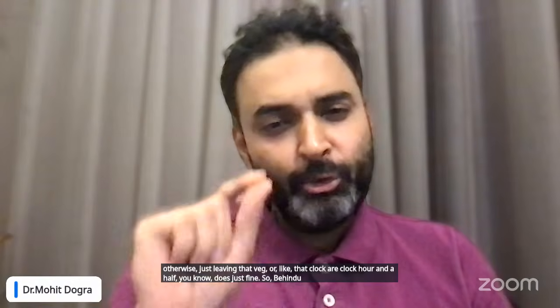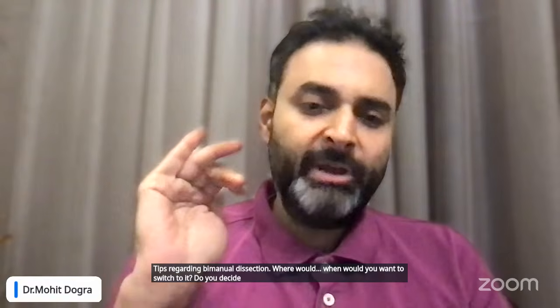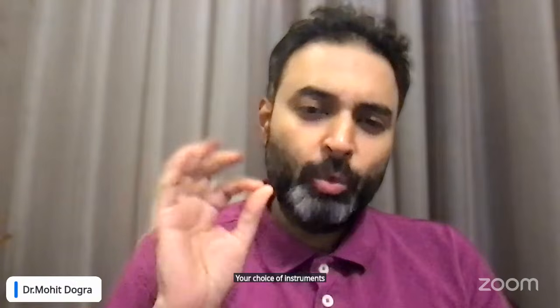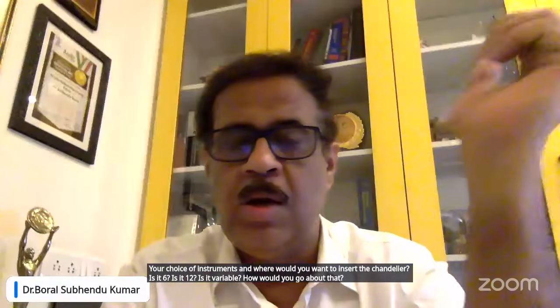Subhendu sir, I'm going to come to you. Tips regarding bimanual dissection. When would you want to switch to it? Do you decide beforehand? Do you decide intra-op? Your choice of instruments, and where would you want to insert the chandelier? Is it 6? Is it 12? Is it variable? How would you go about that? Like not at a 6 o'clock.